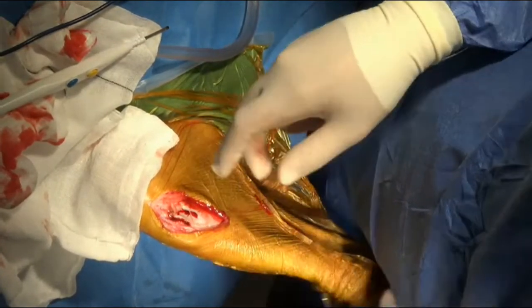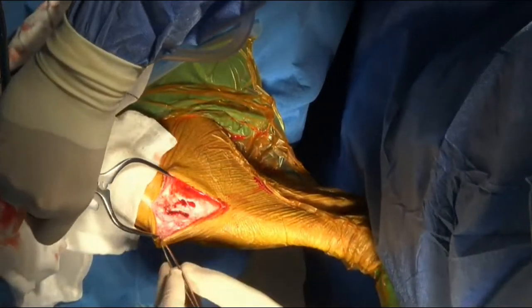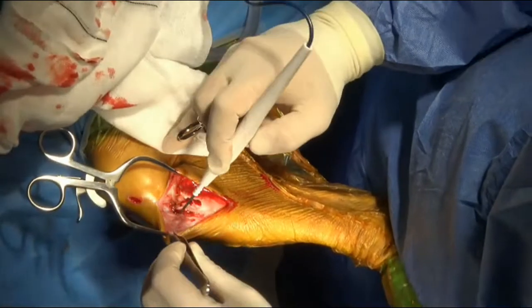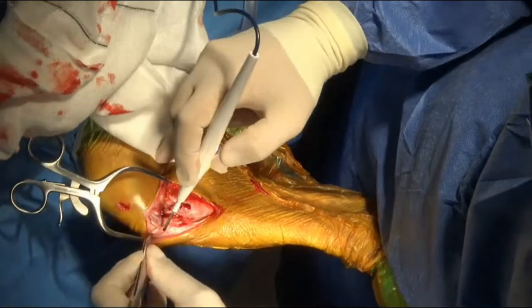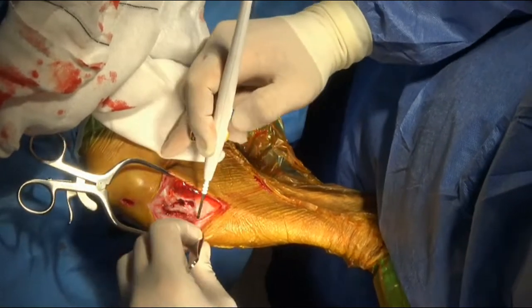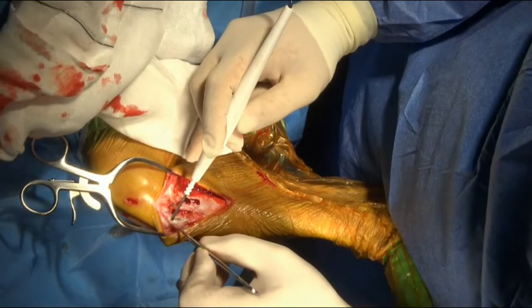Can I get some gelpies, please? Thank you. Right in front of my face, as usual. So a lot of the approach and everything for the CBLO is pretty similar to a TPLO. I do just kind of take the dissection a little bit further off. I'm trying to do this in a way that I can keep the visualization nice for you guys.